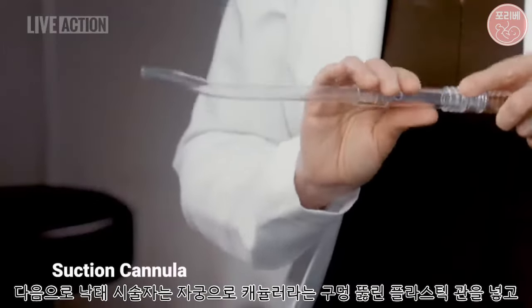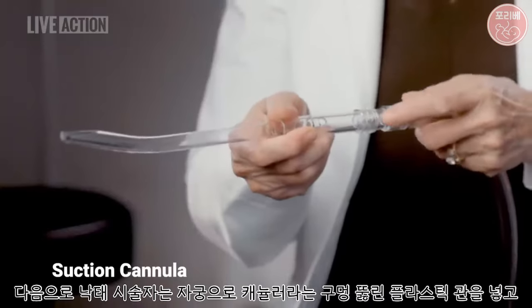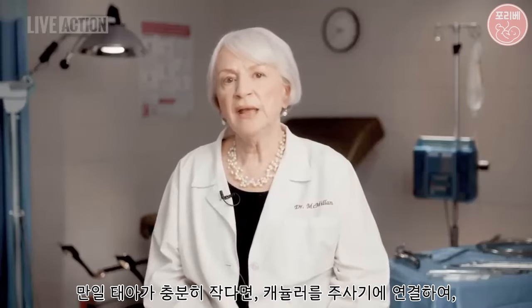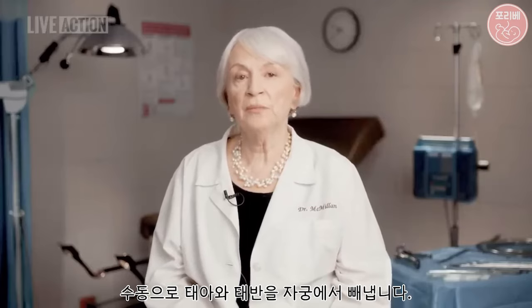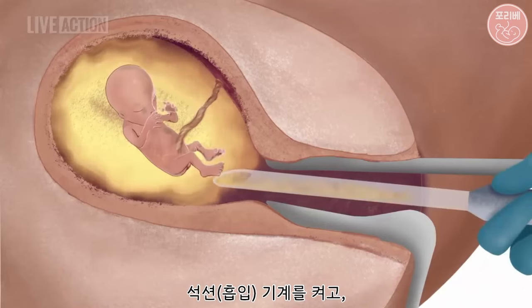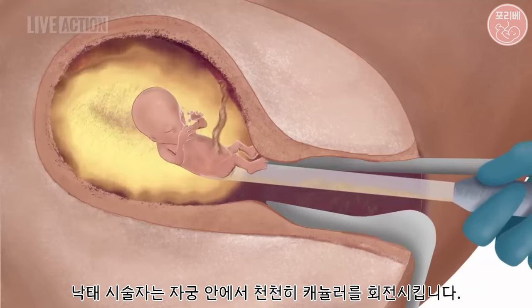The abortionist then inserts into the uterus a hollow plastic tube with a hole in it called a cannula and attaches it to suction. If the embryo is small enough, the cannula can be attached to a syringe, and manual suction alone will remove the embryo and placenta from the uterus. Otherwise, the cannula will be attached to a suction machine. The suction machine is turned on and the abortionist slowly rotates the cannula inside the uterus.